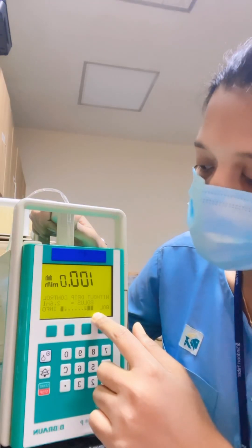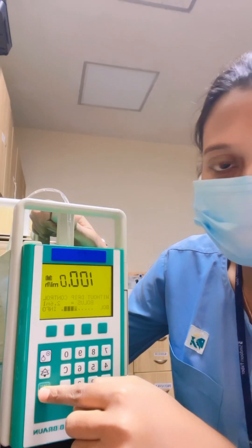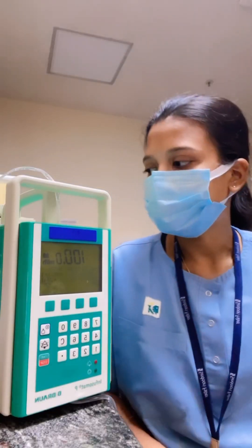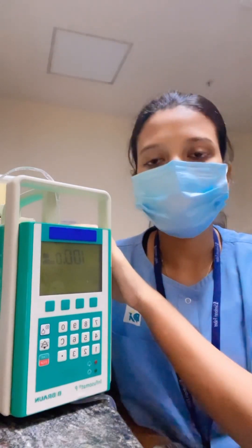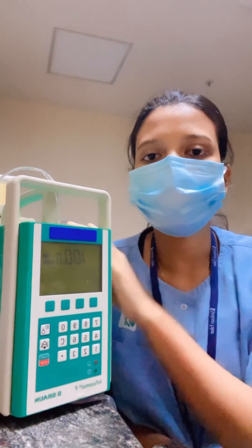For stopping the infusion, press stop, and the infusion will stop. For safety purposes, never place IV bottles directly above the pump, as it can damage the machine if there is any leakage in the bottle. That's all — thank you.